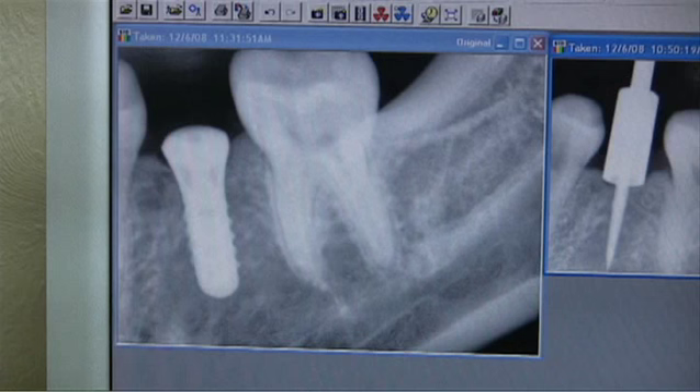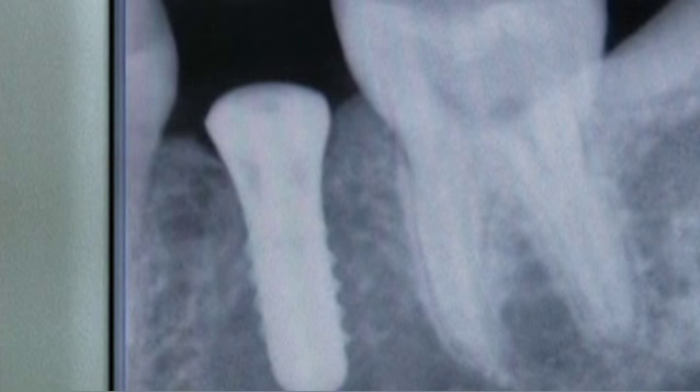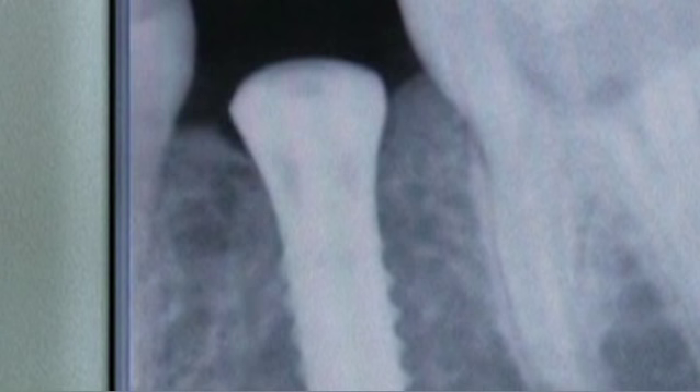The x-ray shows the final implant in the exact position and axis as the pilot drill. The Verbin surgical guide, in conjunction with the Verbin drill stop, allows precise three-dimensional implant placement with a high degree of safety.